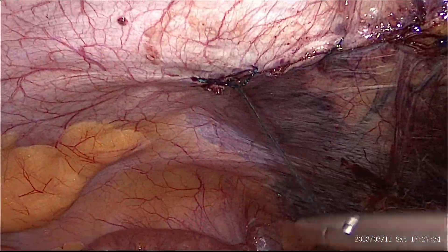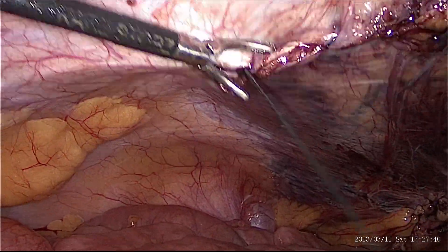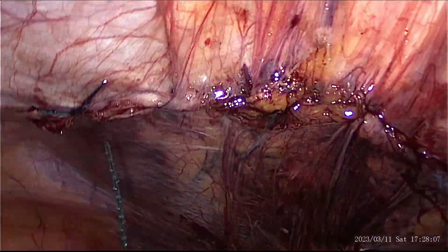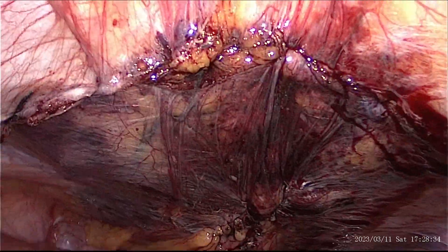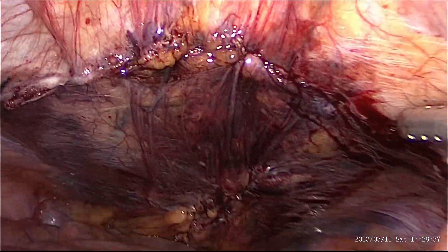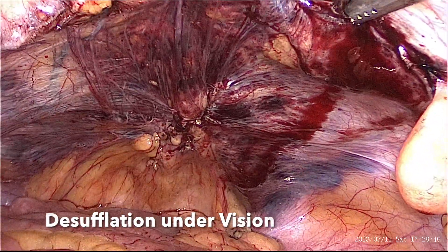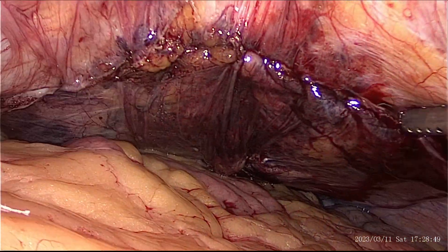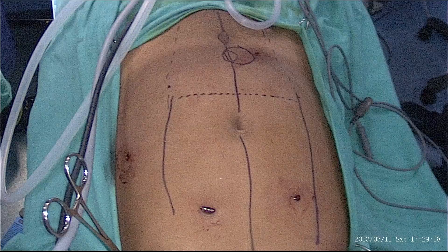After the complete closure of the flap, the next step is to evacuate the CO2 that is trapped inside the cavity. I find this the most exciting step in this surgery. Here is the final port placement with the actual surface marking of the defect.